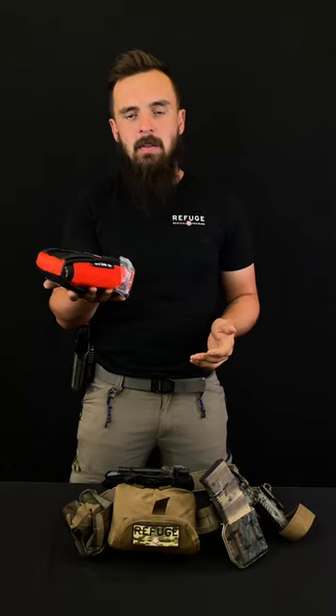Hey guys, Bob with Refuge Medical, and today we're talking about the Small of the Back, or the SOB kit. This kit is super awesome. It's compact, it's light — it weighs about the same amount as an AR mag when it's loaded.